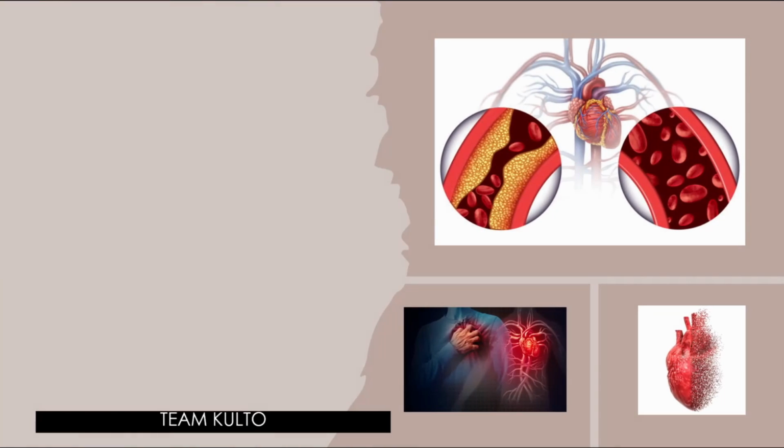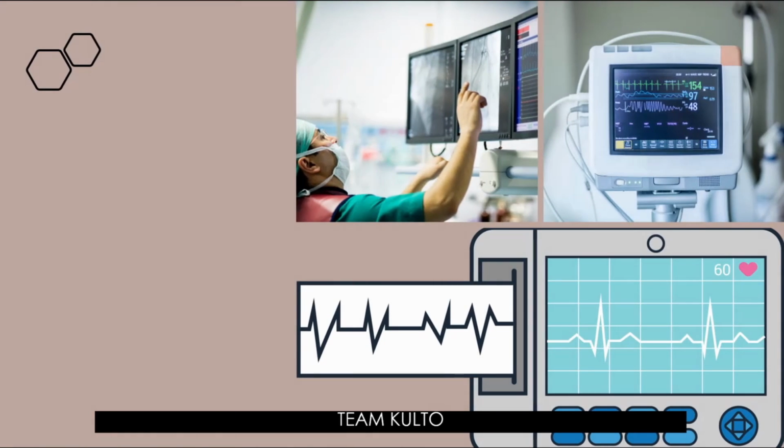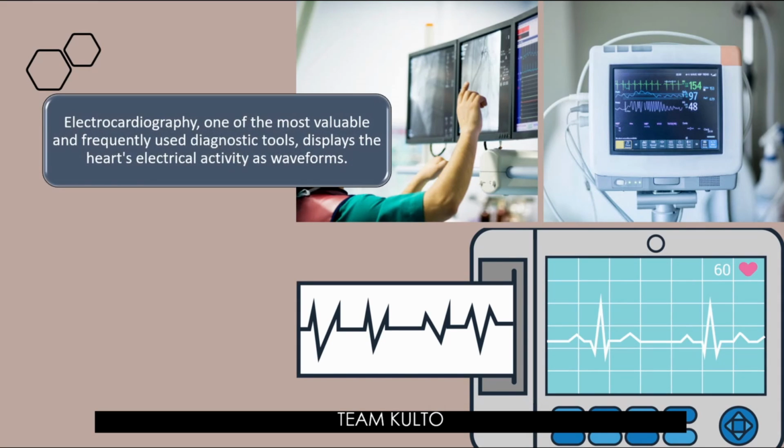Okay. So, coronary heart disease remains a leading cause of mortality worldwide. Prompt recognition and treatment of acute coronary syndrome such as ST segment elevation myocardial infarction, yung ating STEMI, and non-STEMI acute coronary syndrome can reduce and prevent cardiac arrest. Okay? Now, let me also give you this information. Electrocardiography, one of the most valuable and frequently used diagnostic tools, displays the heart's electrical activity as waveforms. Ito siya, waveforms, diba?